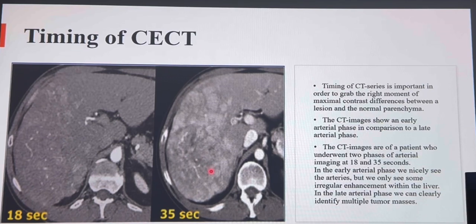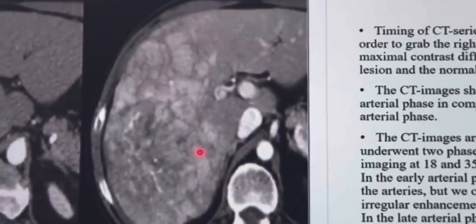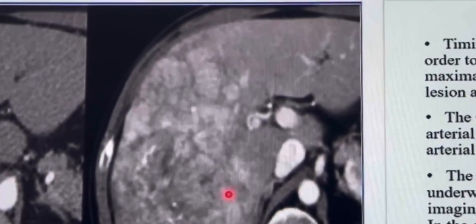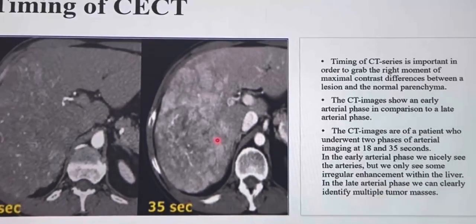lobe. If we go to the late arterial phase, we discover that there are multiple big lesions in the right lobe. Why? Because these lesions are supplied by the arteries. The organ becomes enhanced; the liver has its maximum enhancement from the artery here. The lesion is hypervascular, so it takes from the artery. It showed early before the liver enhances, so we can detect it. If you have good knowledge, clinical and as a technologist, about what I am saying, easily you can manipulate these pathologies. Okay?